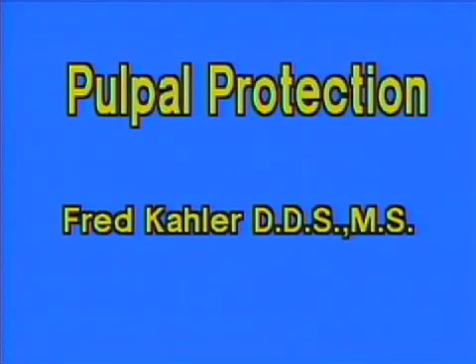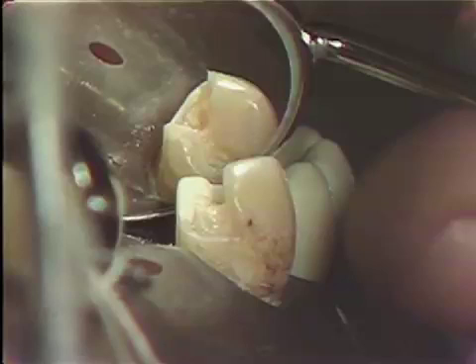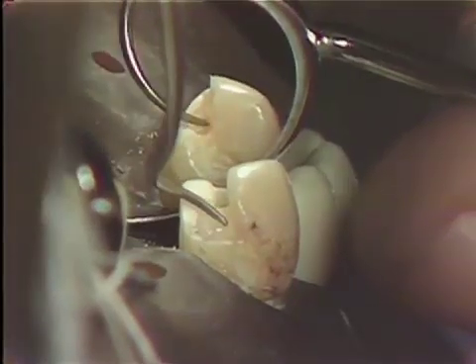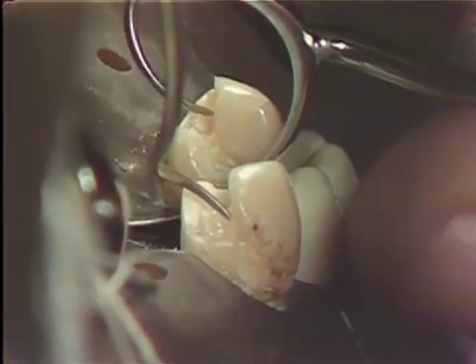For proper pulpal protection, a zinc oxide base and a zinc phosphate base will be placed. Note there is a good deal of dentin removed beyond the dento-enamel junction in this area on the axial wall.